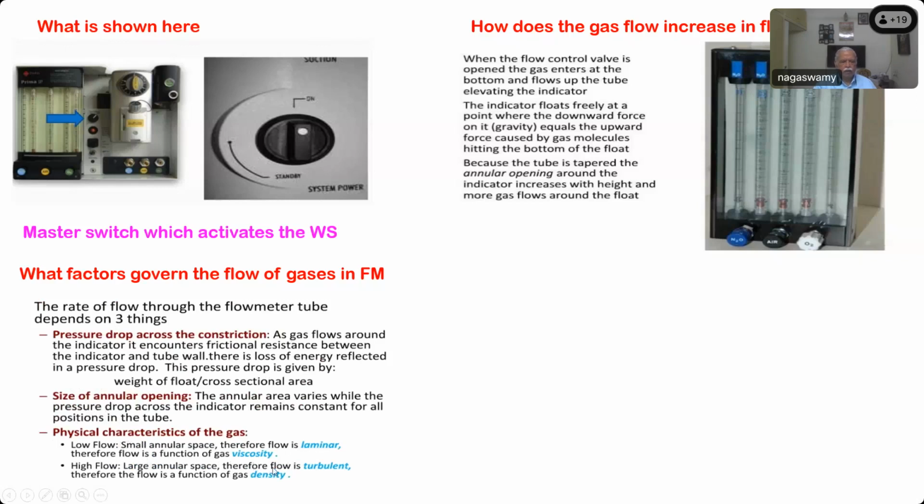What are all the laws involved in that? Hagen-Poiseuille's law. Again, Graham's law. Hagen-Poiseuille and Graham's law. Very good. Okay.